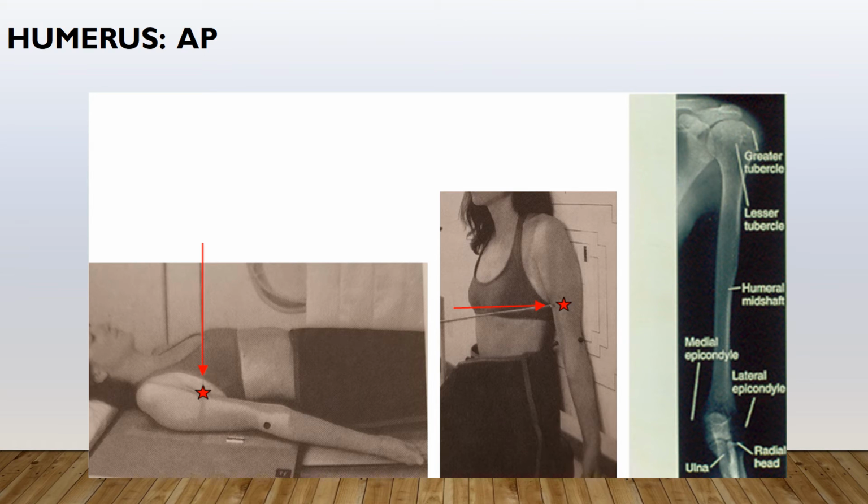You can put a karate chop on the elbow, a karate chop at the top of the humerus, and then just bisect those 2 areas, and that's where you want to center, is to the mid-humerus. You want to make sure the patient is palm up. And when you're doing that, you're going to see that the shoulder is going to turn out away from the shoulder joint.